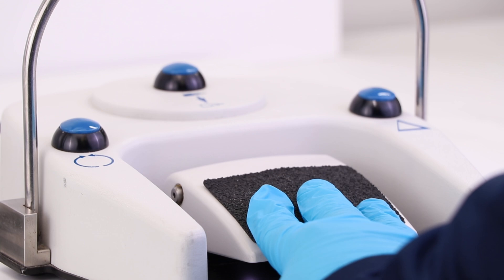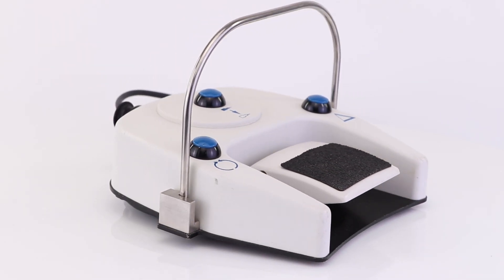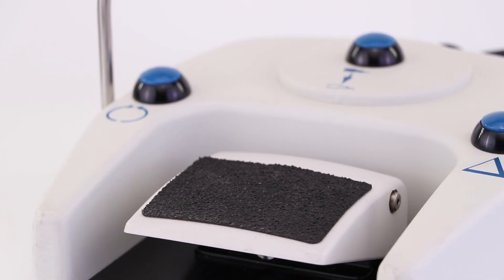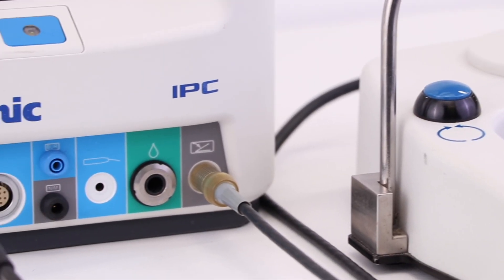The IPC foot pedal is multifunctional and offers ergonomic control at your feet. It has three buttons for maximum control during ENT surgery. The non-slip design and compact size make it ideal for operating rooms. The hoop locks firmly in place and then collapses easily for storage. It also has a built-in footrest for an ergonomic angle and comfort.